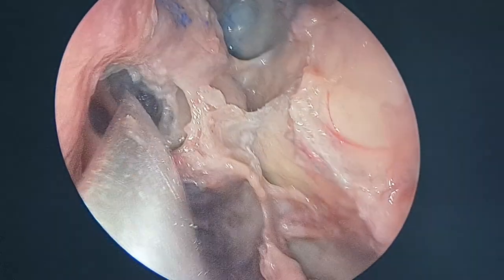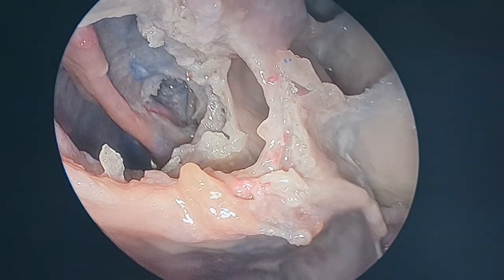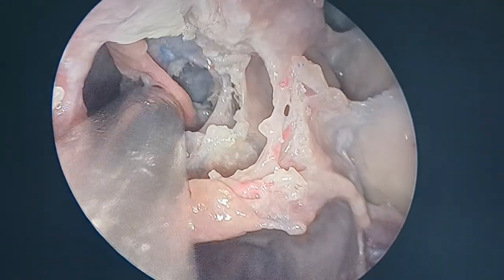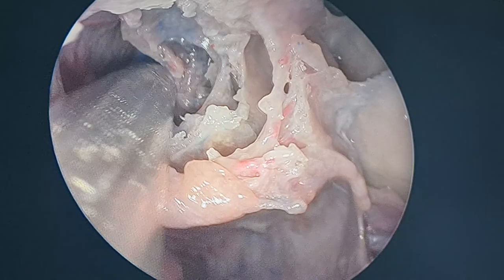So what is to be done? The best way: follow medially, see the superior turbinate. I will take the lower one third of the superior turbinate without any problem. It doesn't contain olfactory fibers or anything, only the lower one third.